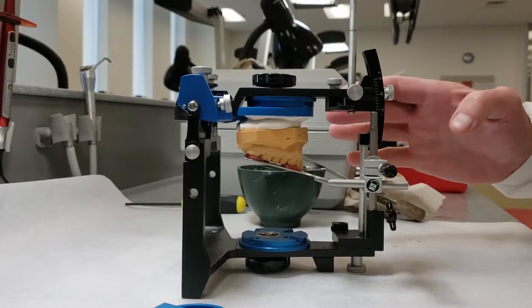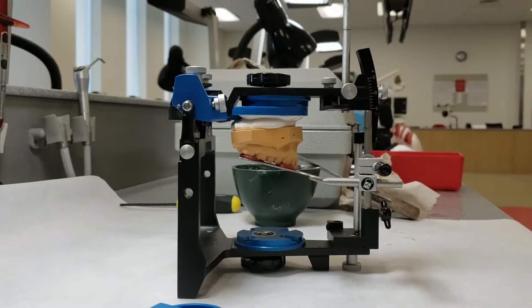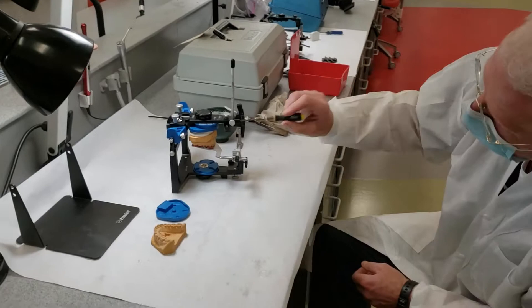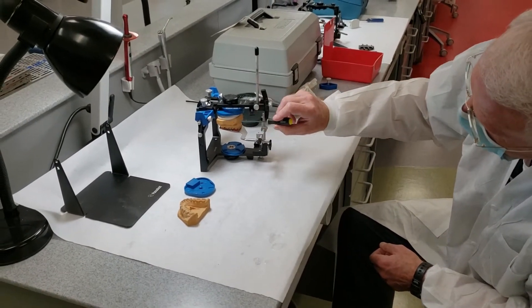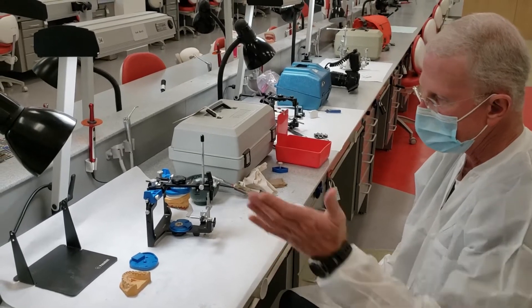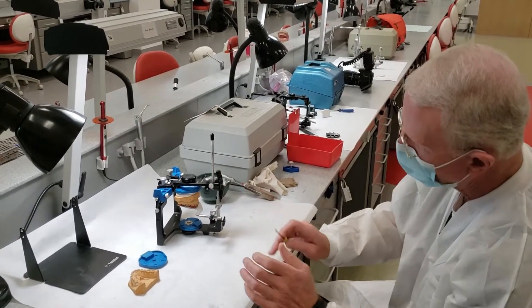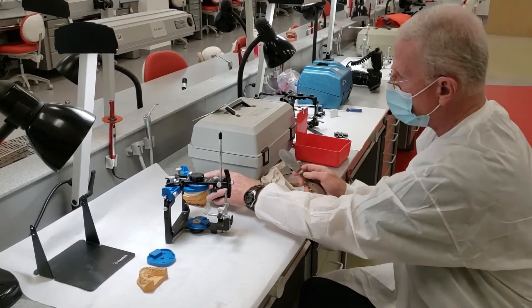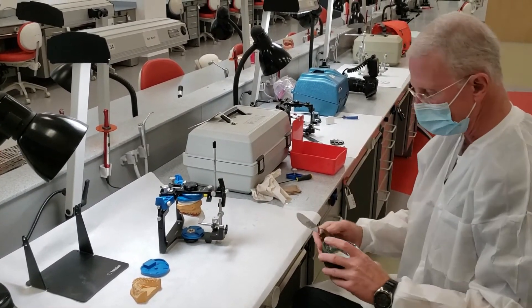We don't want to create a smooth edge or junction between where our mount is and where our cast is, so that if for some reason we have to remount it, we can easily put a blade in there, tap it, and they come apart. So we'll basically just let that set up. Now we'll clean up our stone.